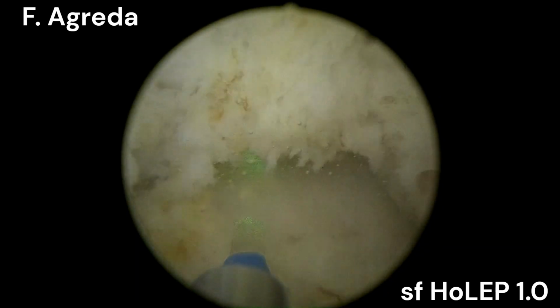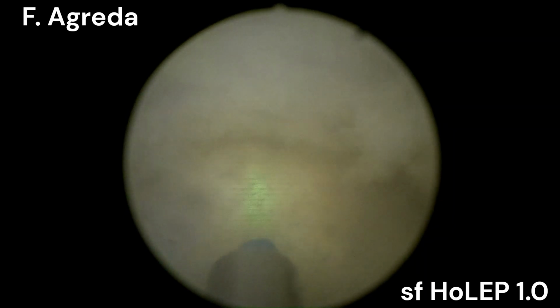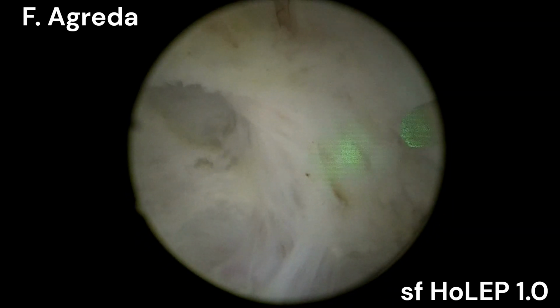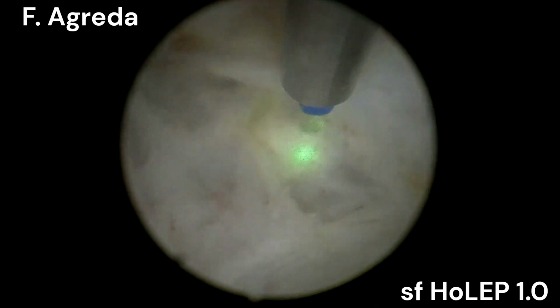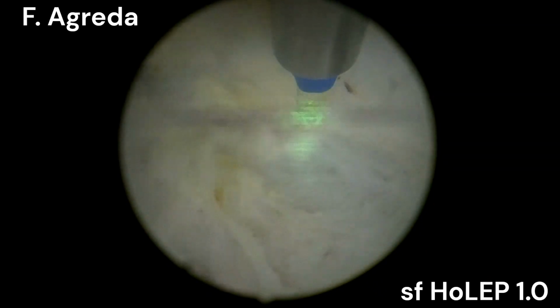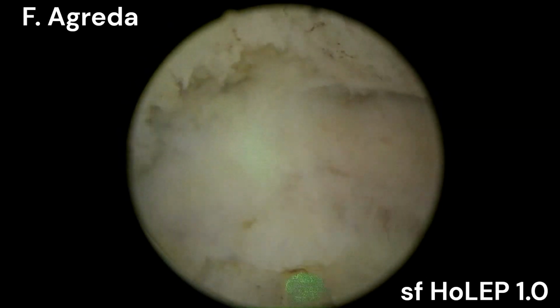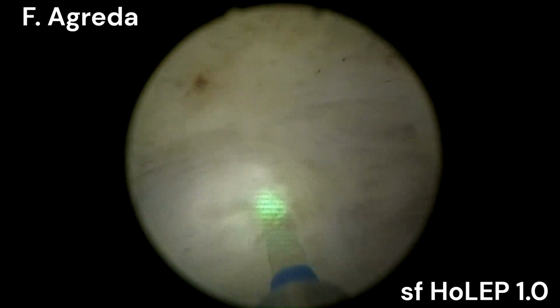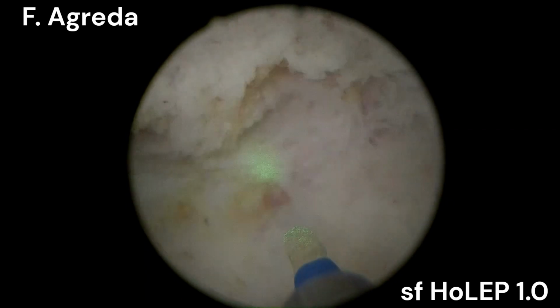Here I start with the laser in the 6 hours position in my scope, and then when I have set a little bit of space, I change it so I can go very close to the adenoma to avoid any kind of capsule perforation and avoid extravasation of fluids or any kind of problem that can come with the capsule perforation.